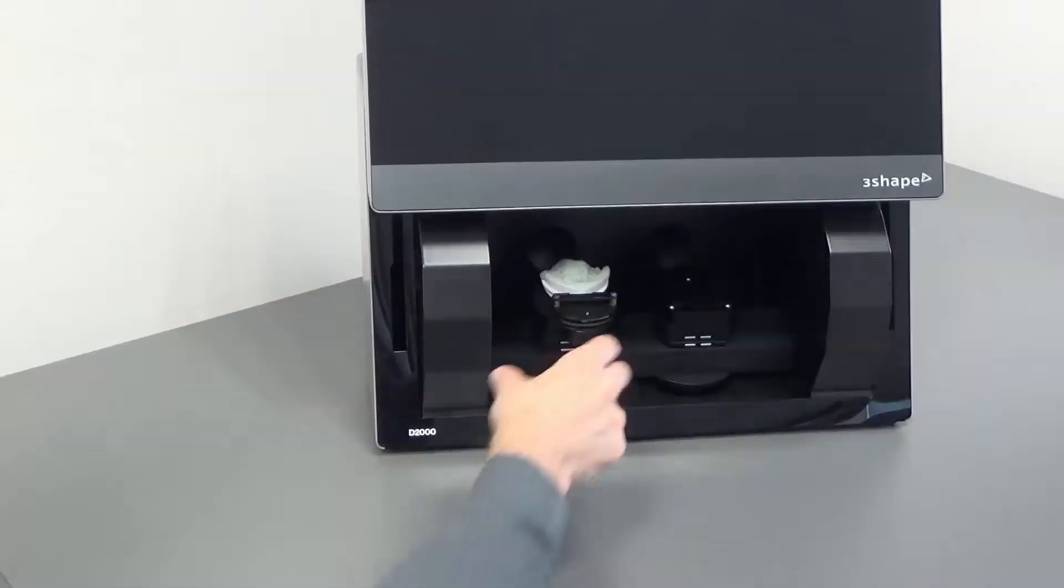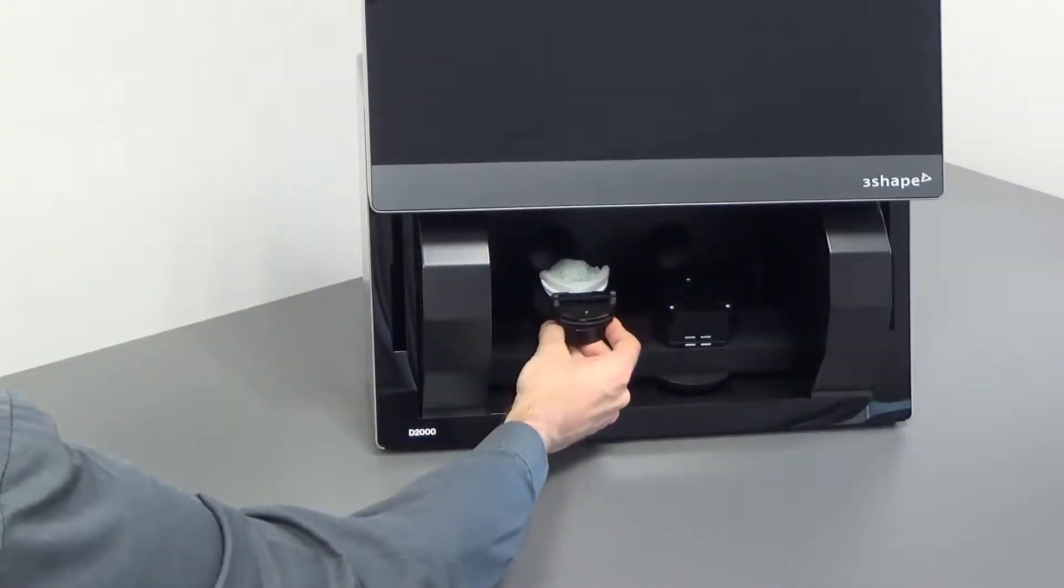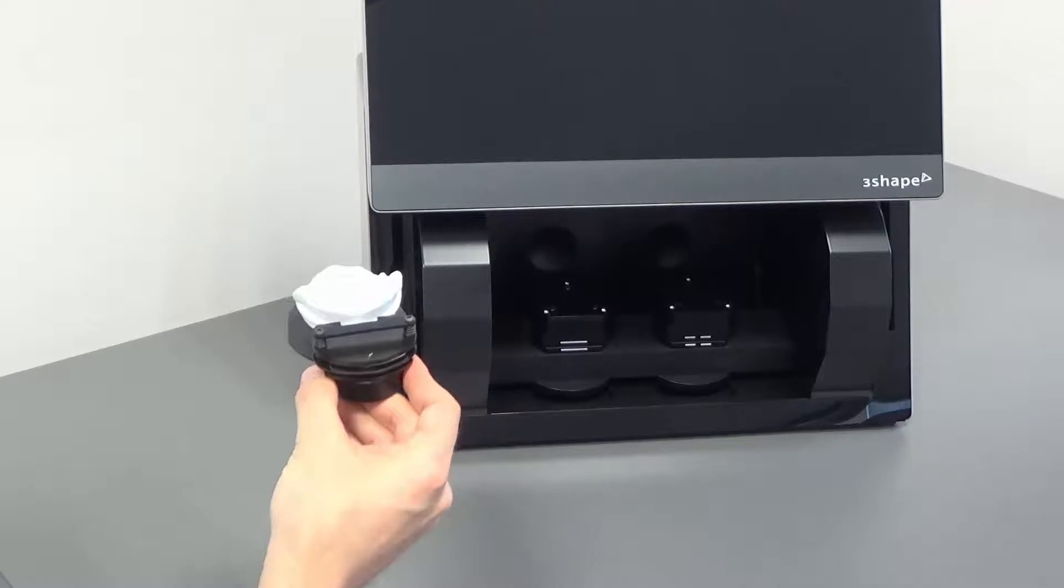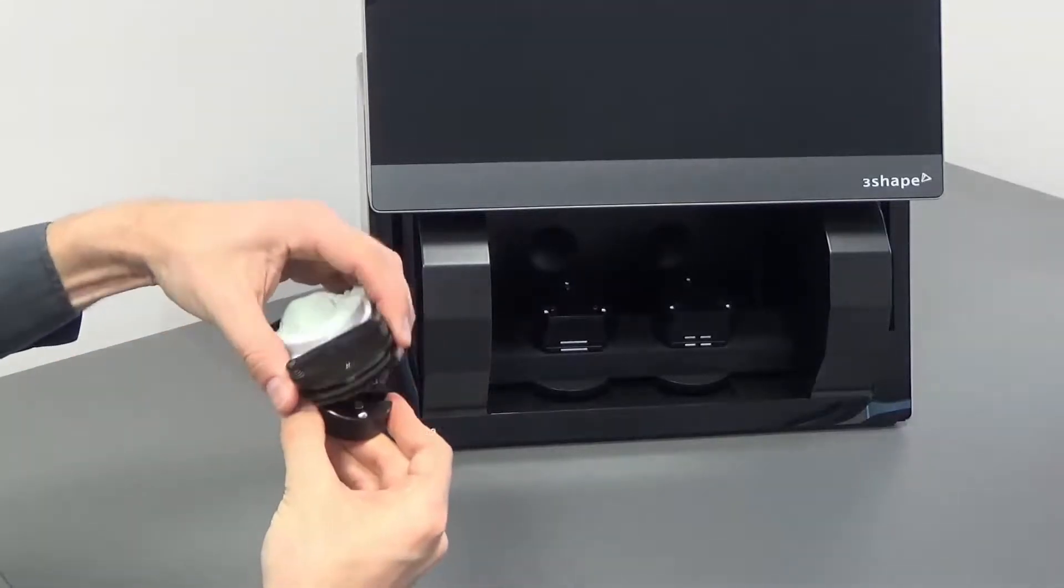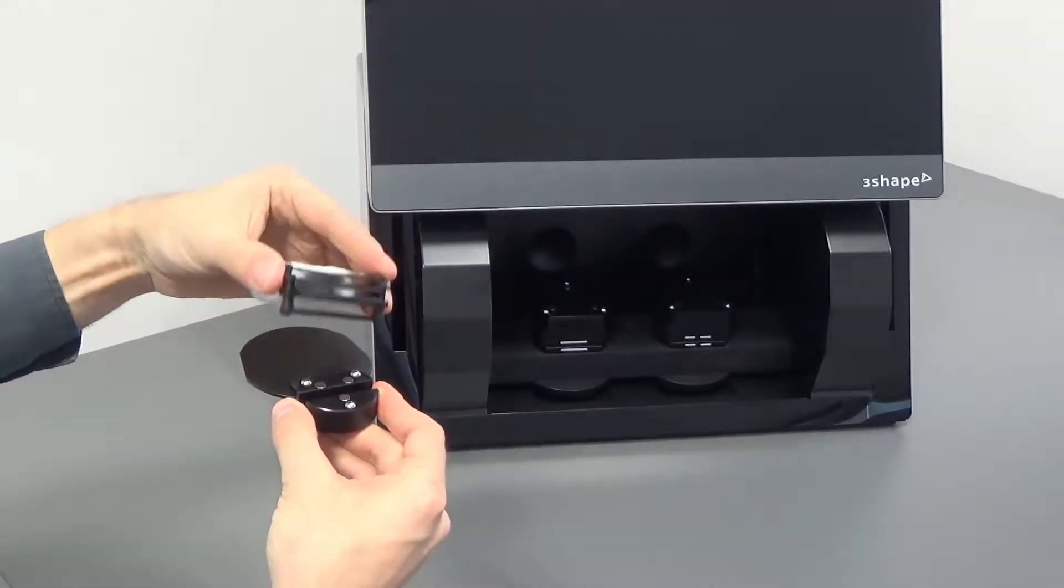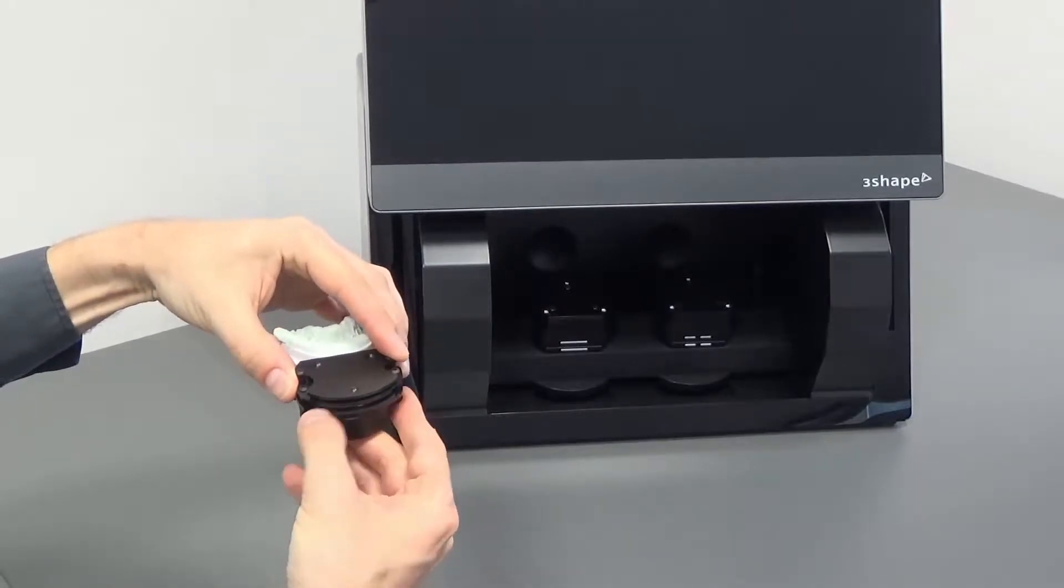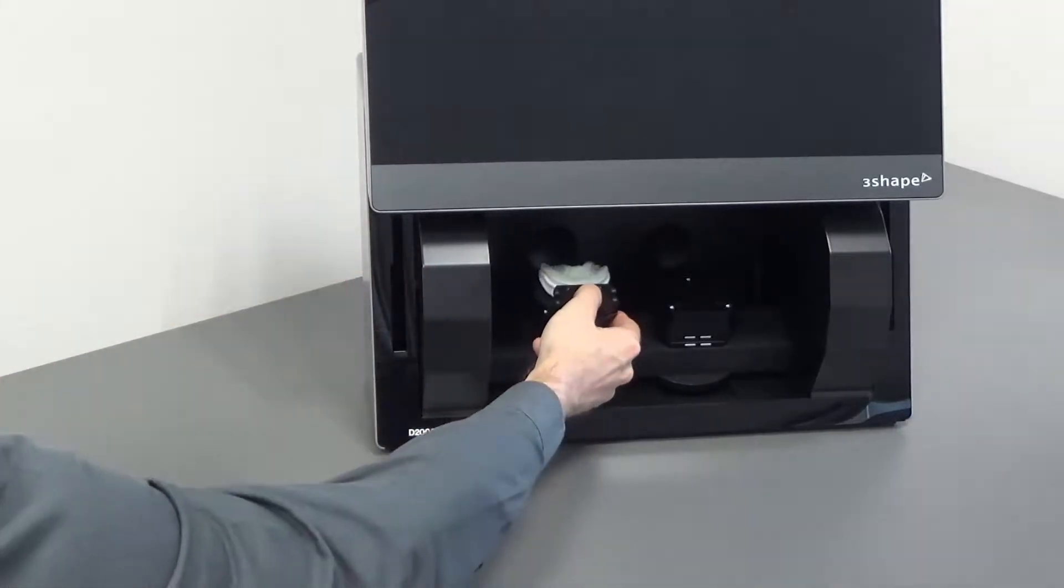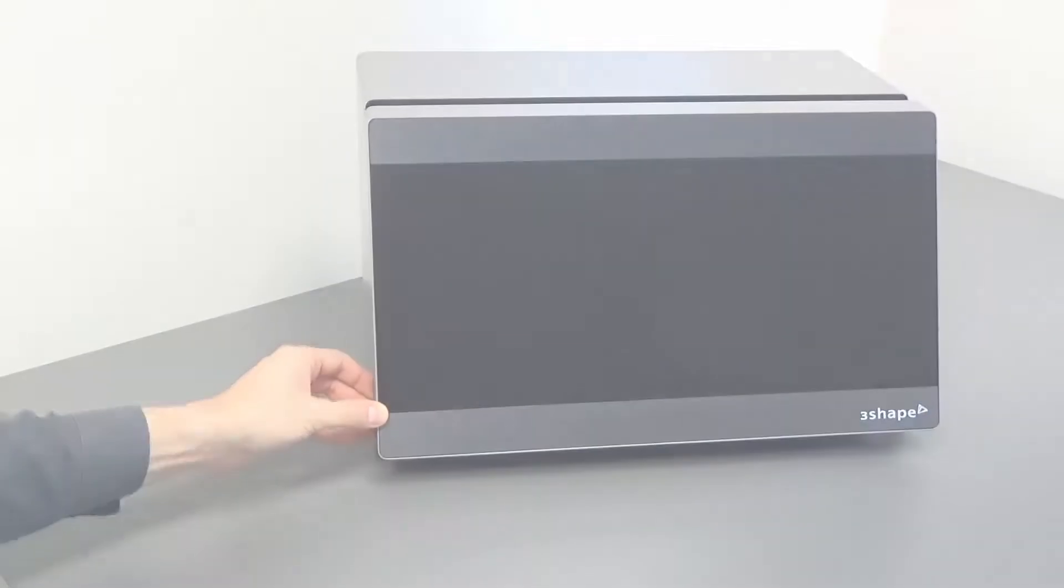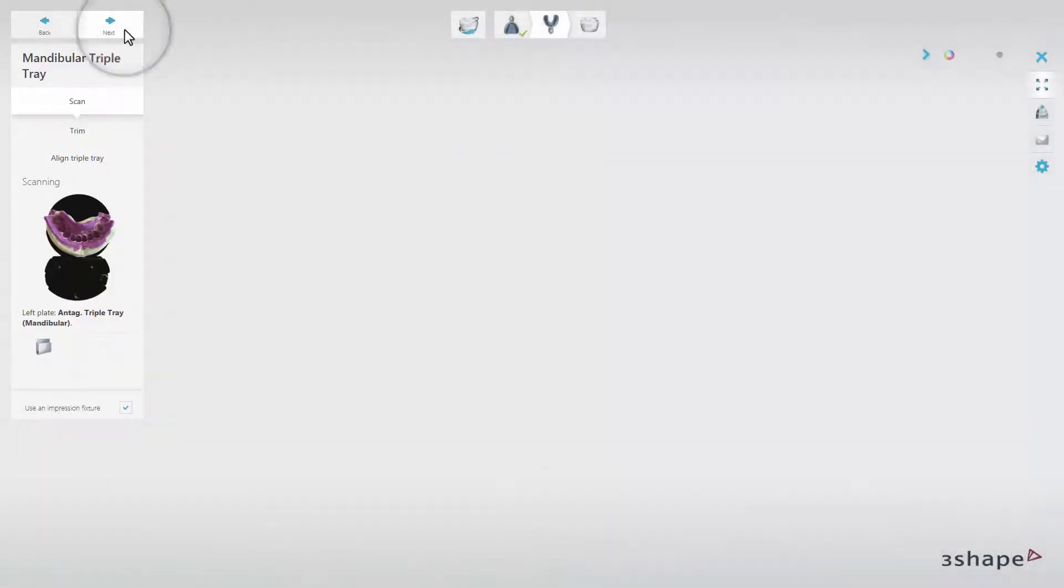Now remove the impression fixture from the scanner and flip over the part of the fixture that holds the triple tray to be able to scan the antagonist. Then insert it into the scanner according to the information in the overview window and click Next to start scanning.